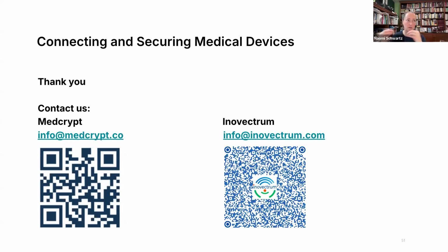Software of unknown provenance or open source software or off-the-shelf software needs to be assessed for risk, because if it's open source and it's being maintained intermittently, at least you have evidence of some kind of maintenance. If it's not being maintained, you probably need to ask whether or not you should keep using it, because if something goes wrong, you might be waiting a very long time for somebody to do something about it, and that's on you, not on them, from an FDA perspective.